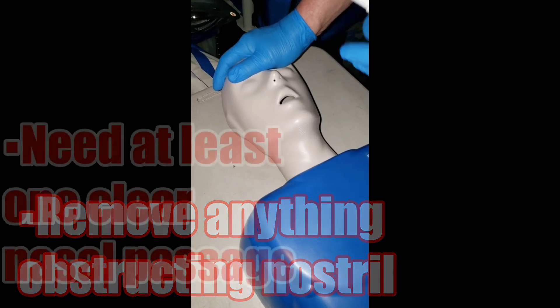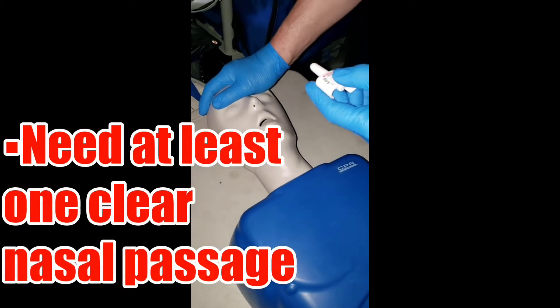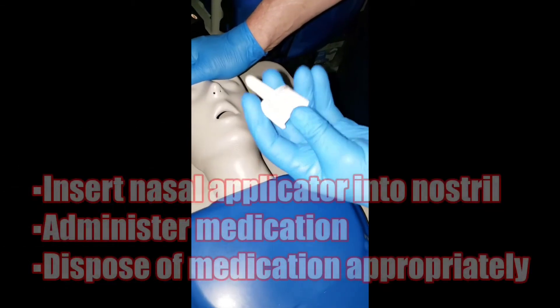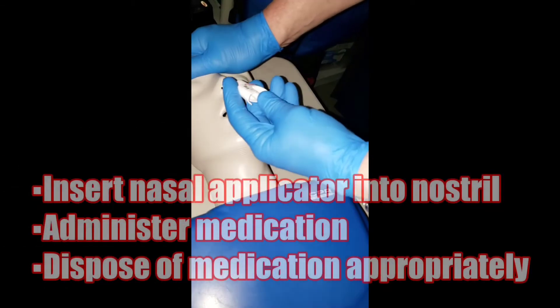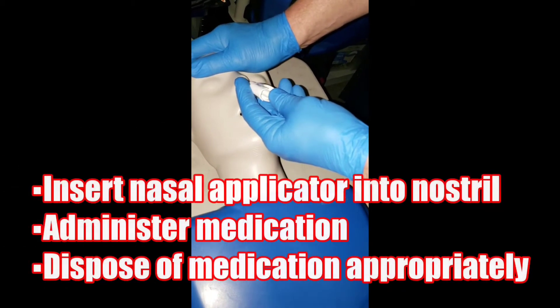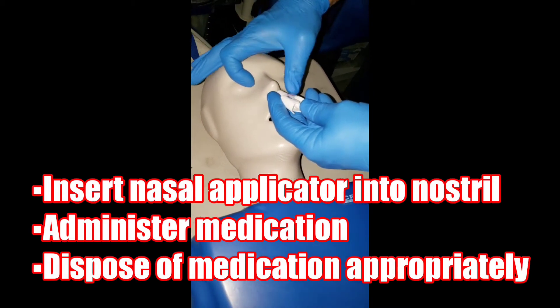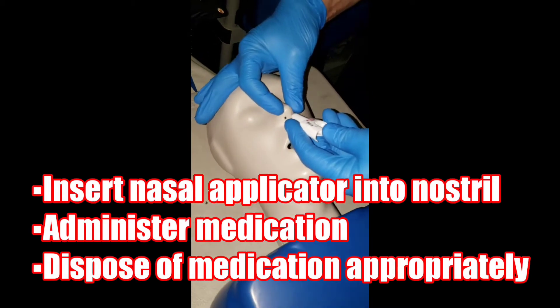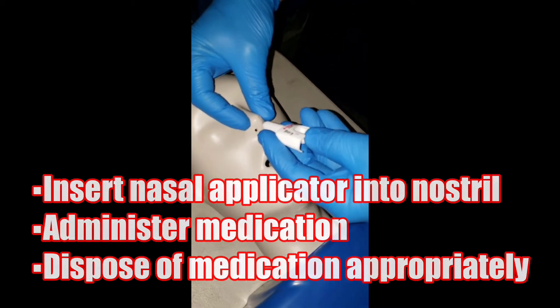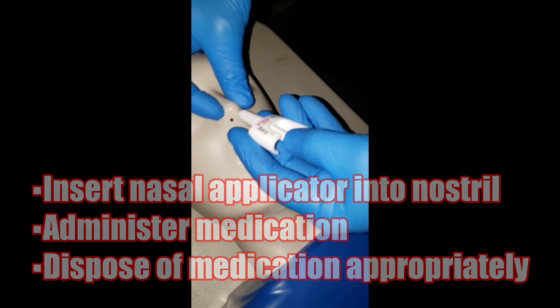At least obtain one clear nasal pathway. Then insert the injector nozzle into the nasal cavity, securing it with your fingers to get a tight seal, and then press the plunger to deliver the drug.